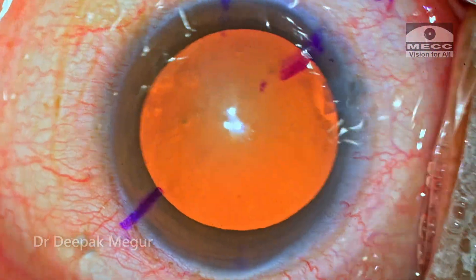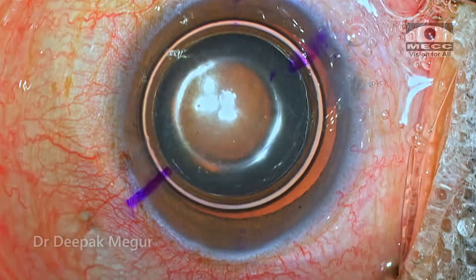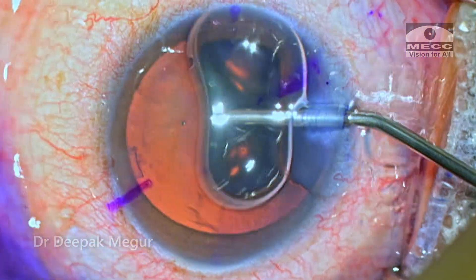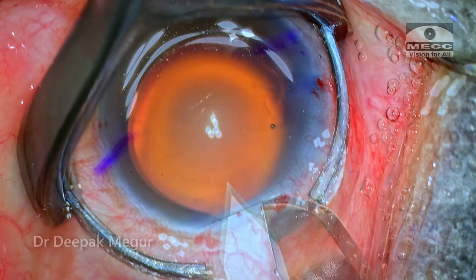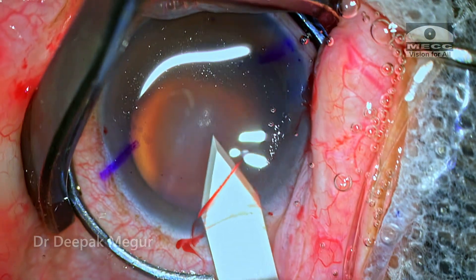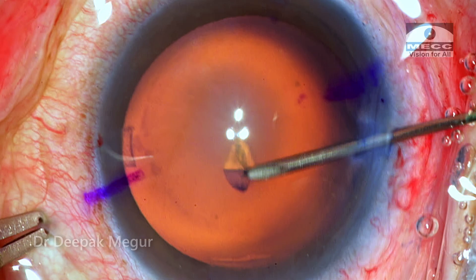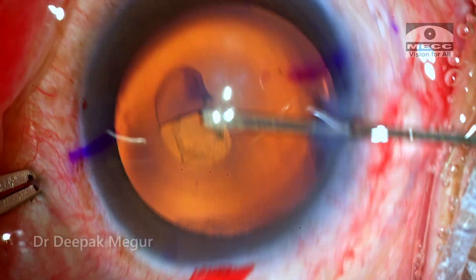Let me go through the plan which I follow when performing surgery in myopic eyes. The side port incisions are created and one of the most important steps is to get your rhexis very well centered and very well sized. To get the lens to center well in a bag which is very big, one needs to have an appropriately sized rhexis. The chances of decentering will increase whenever we have a larger rhexis that is more than the optic of the lens. I am aiming for a 5 mm well-centered rhexis — that is probably the most critical step in these myopic eyes.